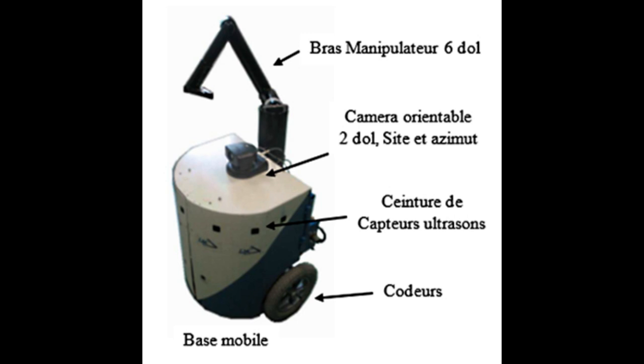The robot is a system that can perceive, act, decide, and communicate to interact with the environment, autonomously or in cooperation with humans. We aim to help disabled people benefit from the service provided by the robot for two reasons.